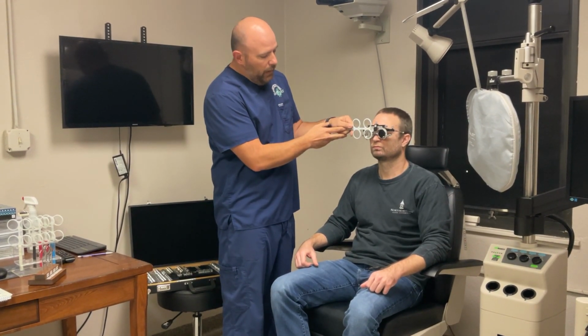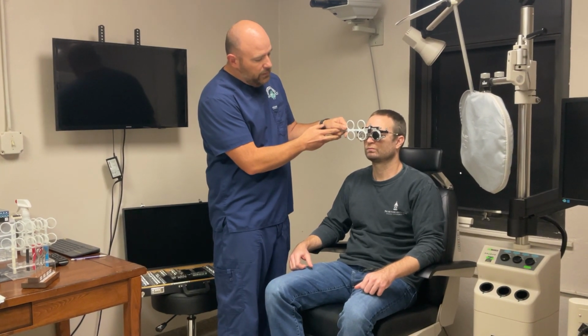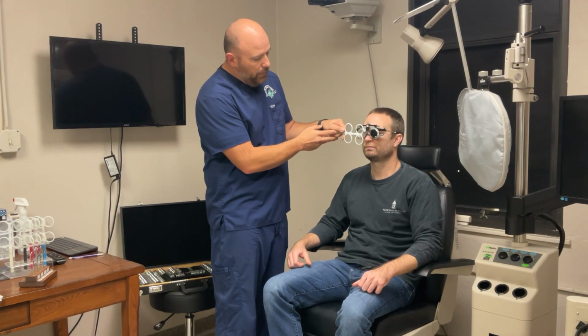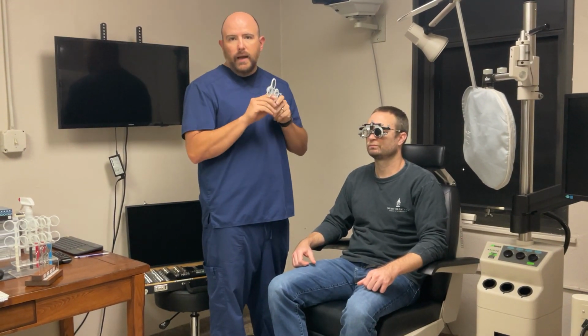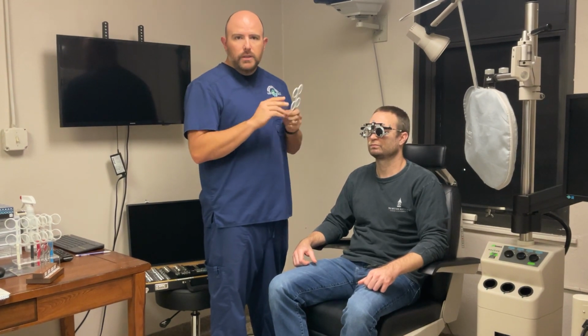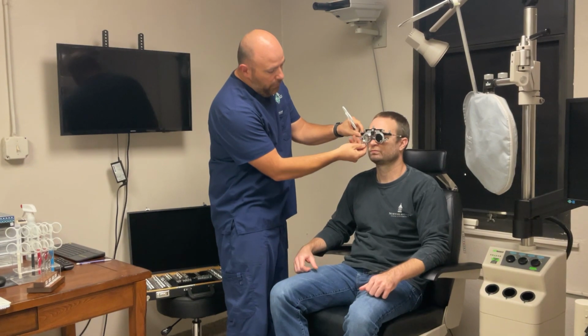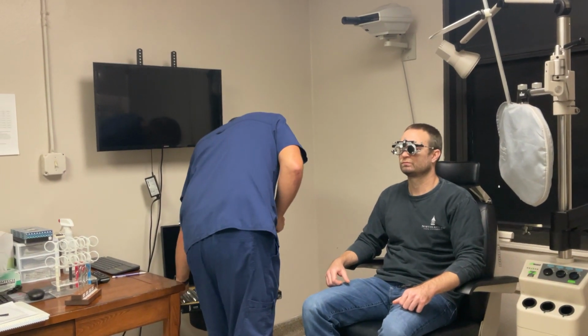All right, so now I'll have you look up there and tell me which is clear or which makes the letters more plain, 1 or 2? 1. 1, okay? So we've got a minus 4, and he selected the minus 4.5, or minus the half. So he wants to go back up to a minus 4.50. So we bracketed on the low side. Now we need to bracket on the high side. And so what we're going to do is grab a minus 5.